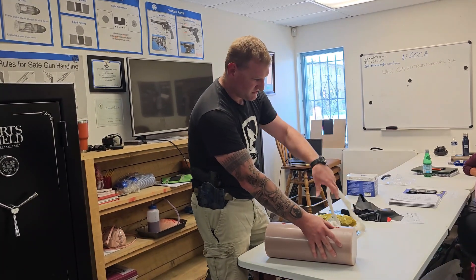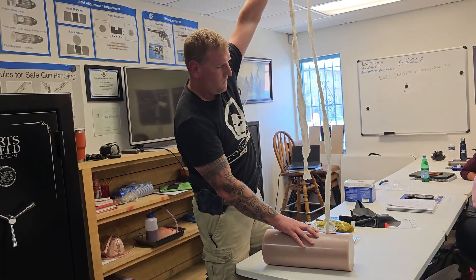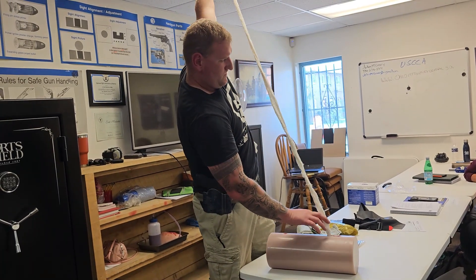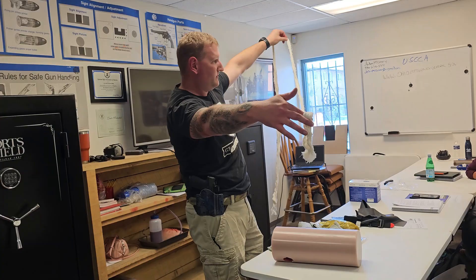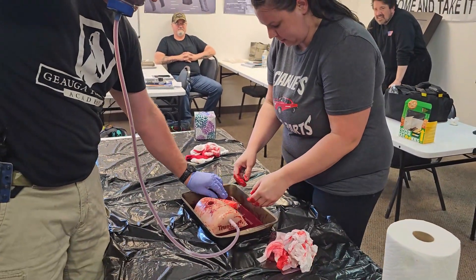Pretty good — check this out from this point. All of that is in there in that wound cavity. There you go — there's your package.